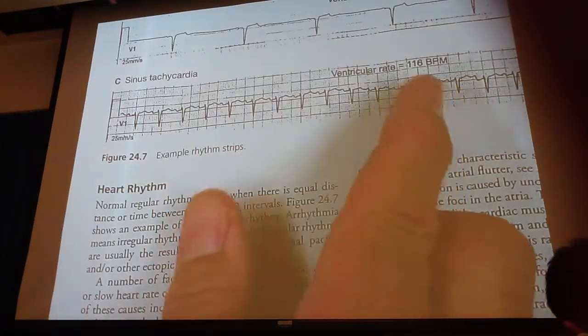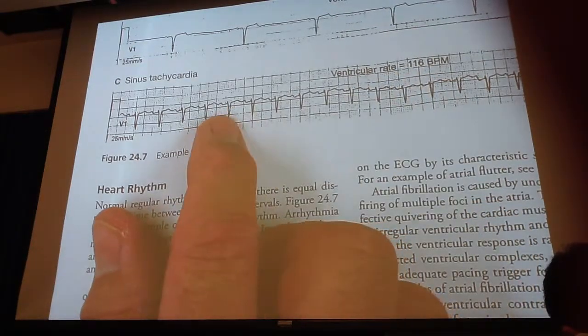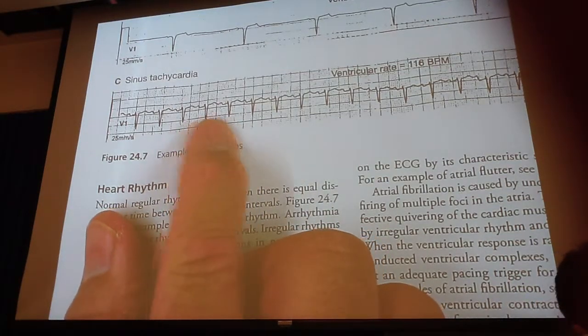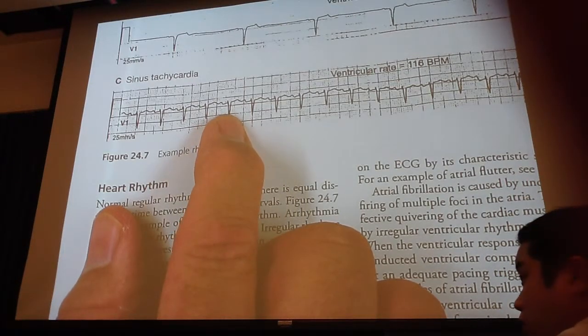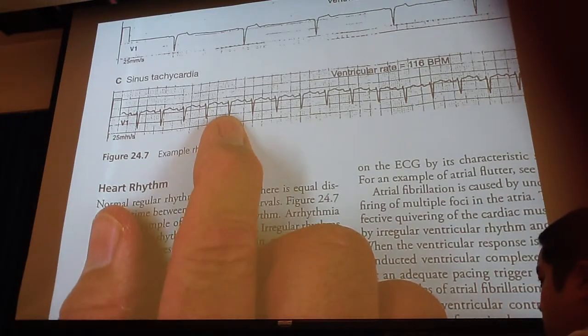So the thing here is, in this case we would normally expect this on a patient that we're either exercising on a treadmill, or what other drug would I be giving the patient that would cause an increase in heart rate? Does persantine or adenosine or lexiscan do this?